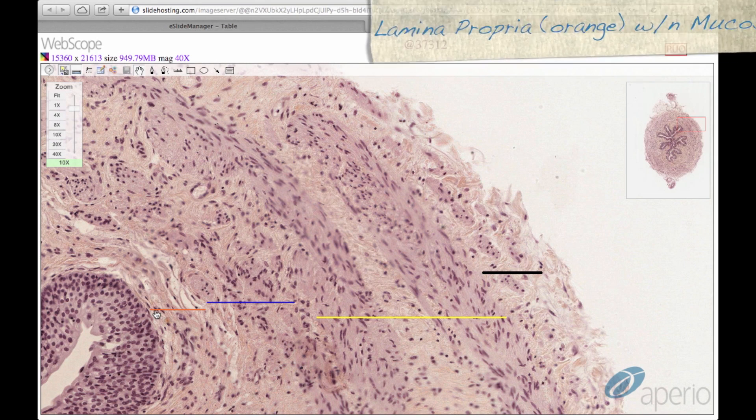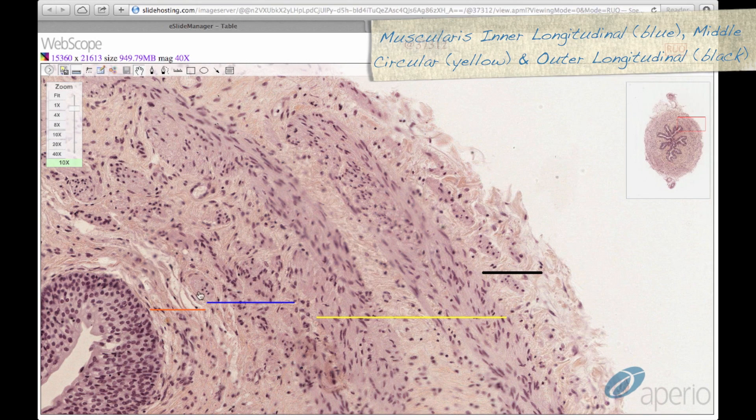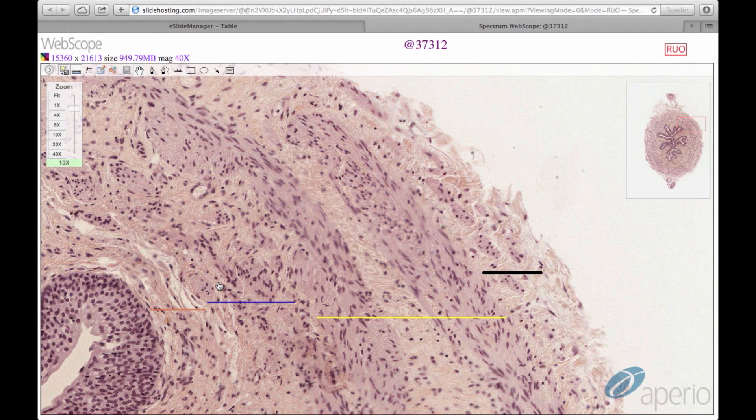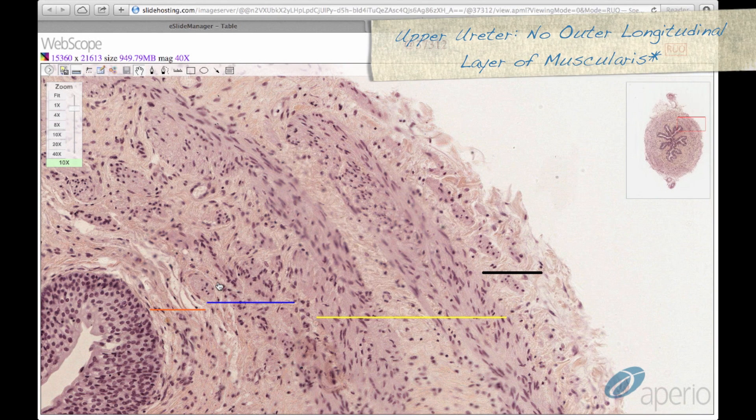In the lower ureter, there are three layers of the muscularis, the inner longitudinal, middle circular, and outer longitudinal, spanned by the blue, yellow, and black lines respectively. Please note that in the upper ureter, there is no outer longitudinal layer of the muscularis.